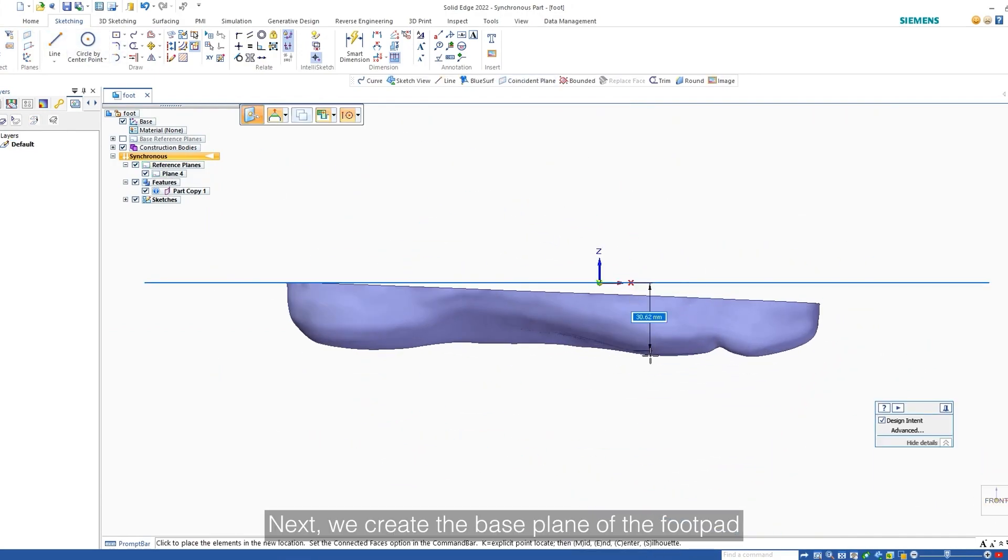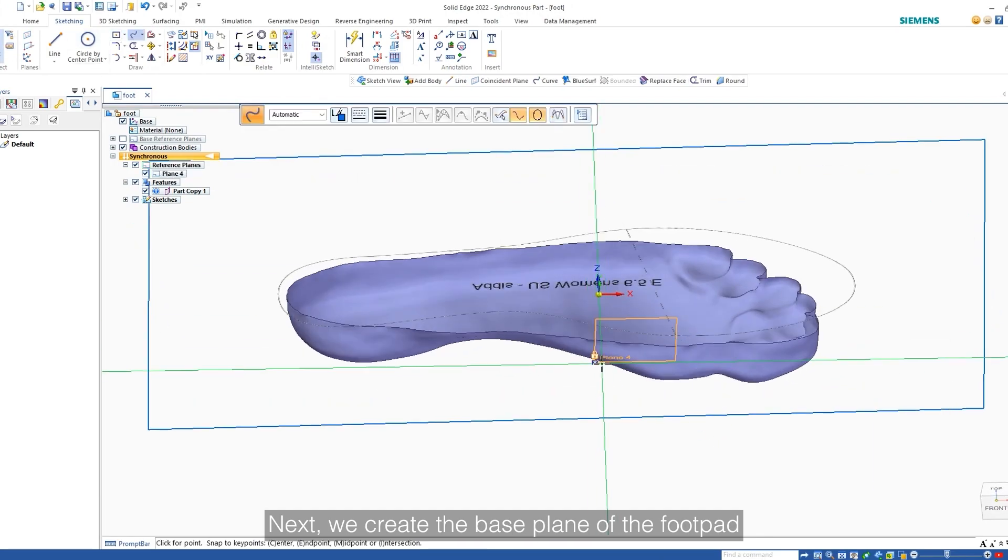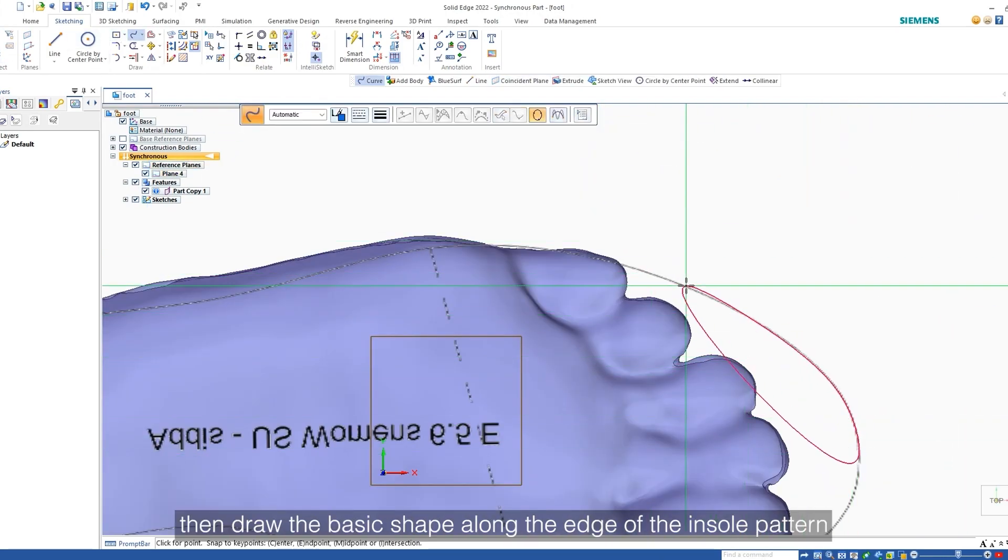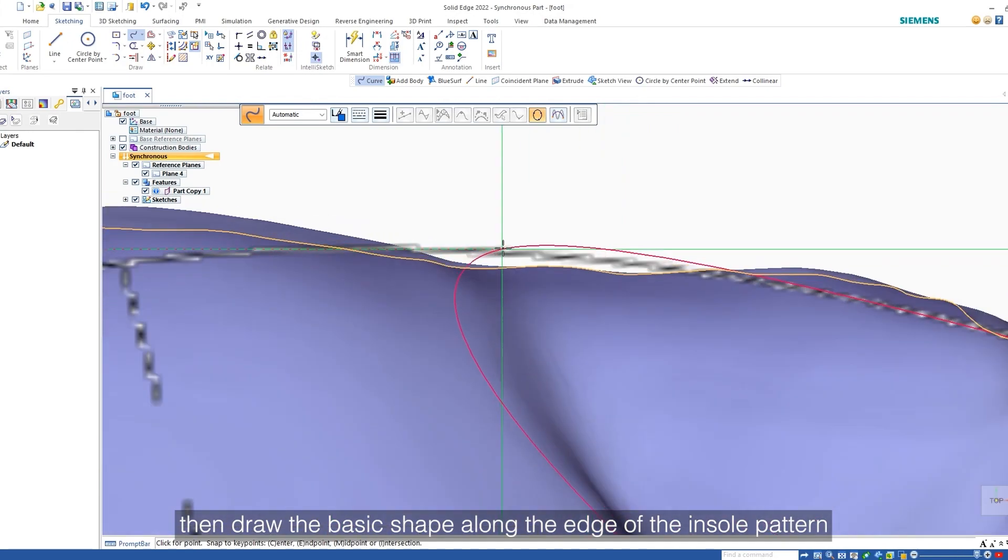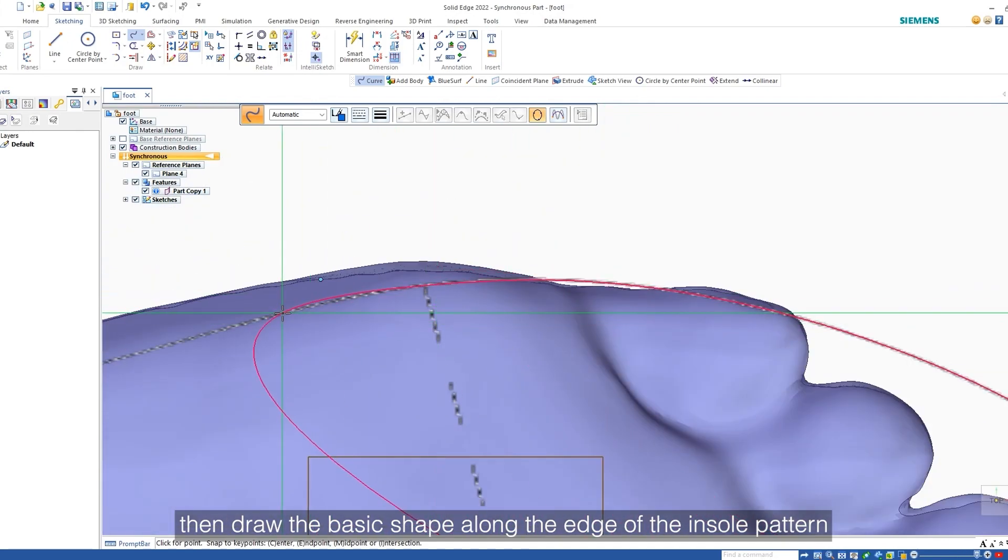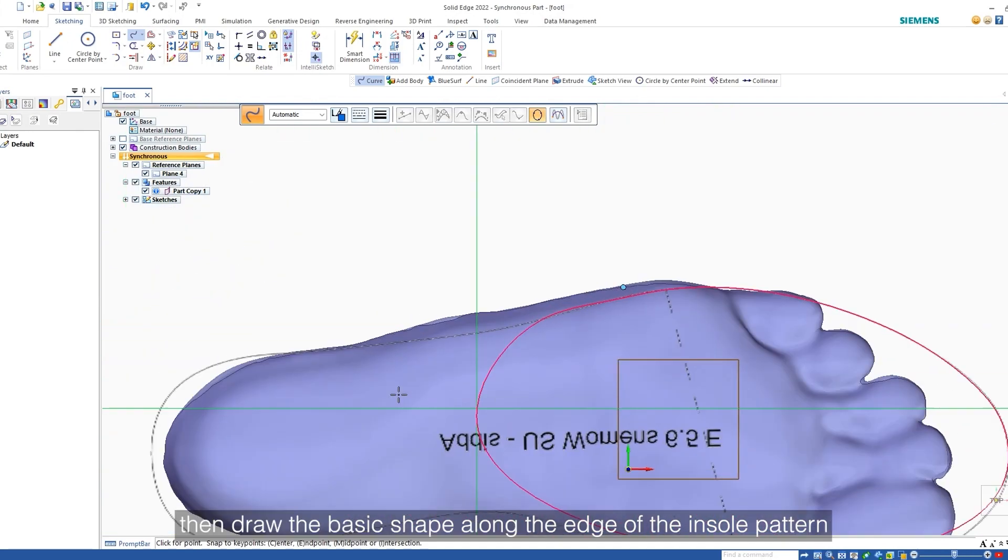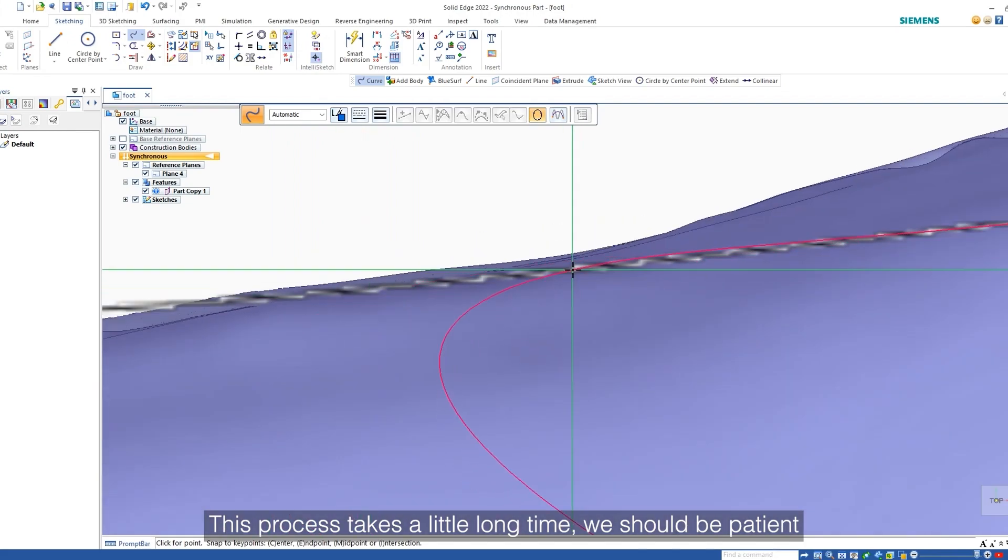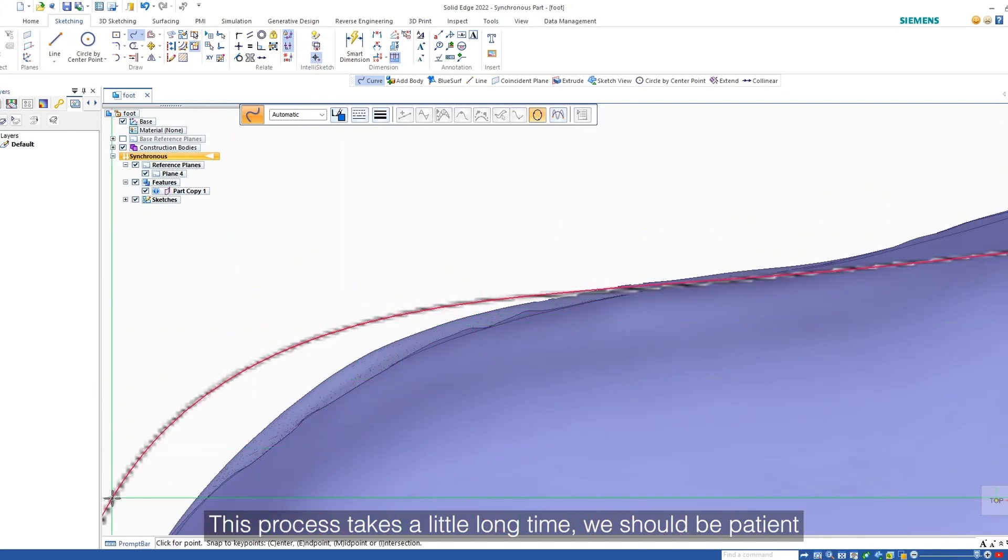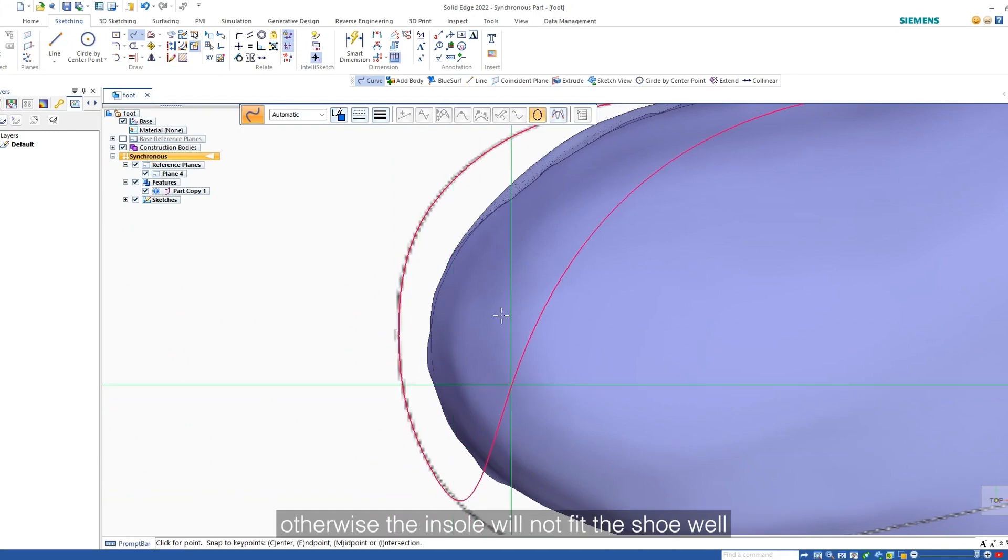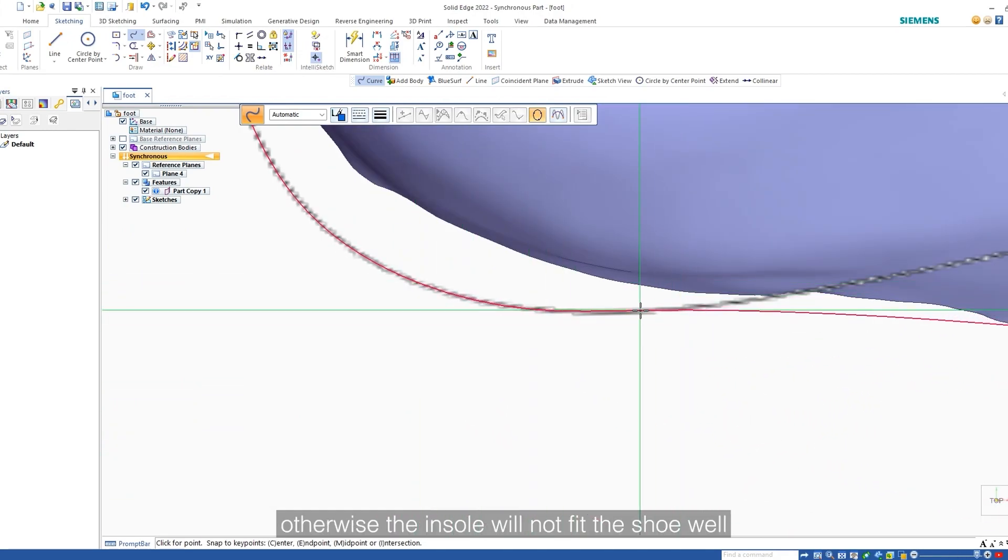Next, we create the base plane of the foot pad, then draw the basic shape along the edge of the insole pattern. This process takes a little long time. We should be patient. Otherwise, the insole will not fit the shoe well.